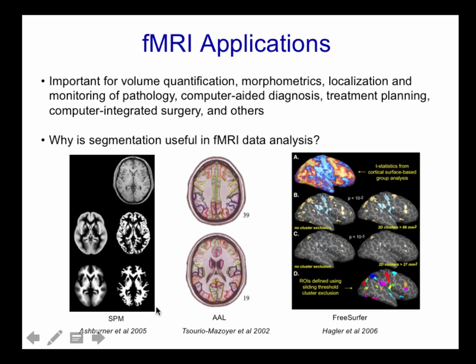And they actually have a process for normalizing your brain. Usually you have an fMRI data set and a corresponding T1 image, and if you want to do a really good job of putting the brains into normalized space, you take the corresponding T1 image and do the registration on that, since it's higher resolution and has less distortion. Their process for doing that normalization is actually a combination of segmentation and registration at the same time. This shows that they're breaking up the tissue components as they're doing this registration process.